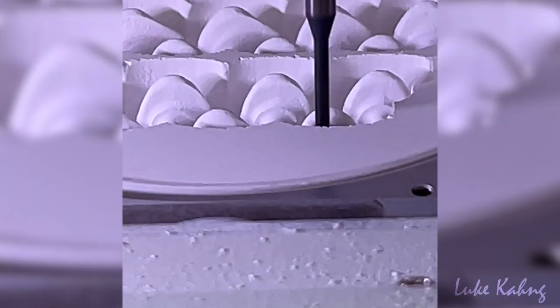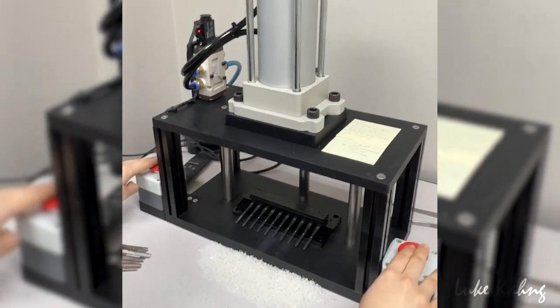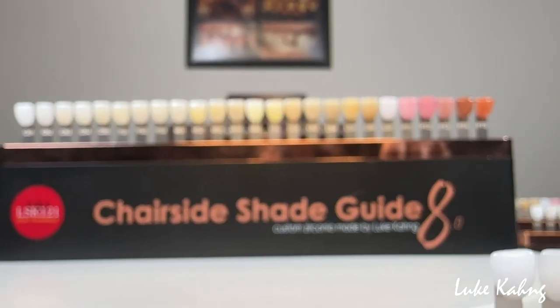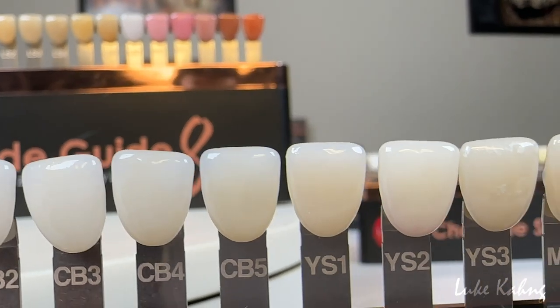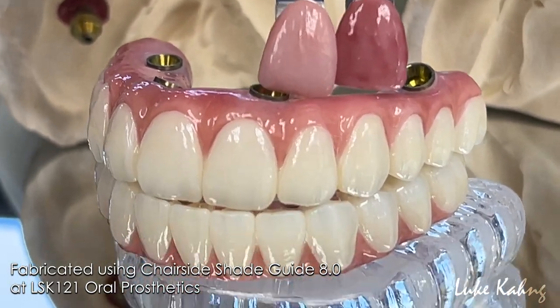So I developed it with zirconia, and the backside has a special design, which was a really hard time to figure out, doing silicone techniques, which I paid for, and I got that. Then I made the design. I failed so many times and really thought hard, and now finally I got it, which is a very exciting moment. I would like to share with you guys, so feel free to use this. With patience, you can get all the different colors and make patients happy.